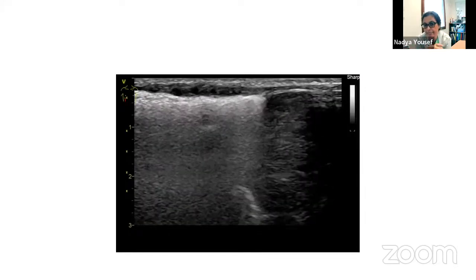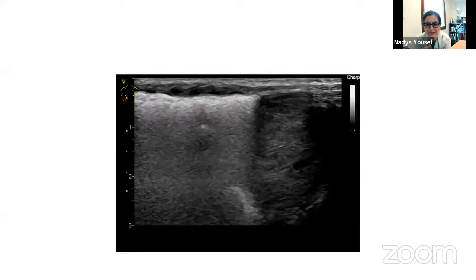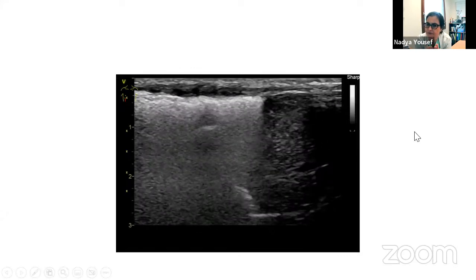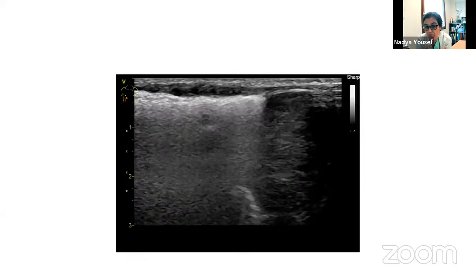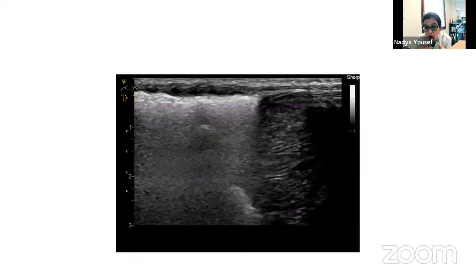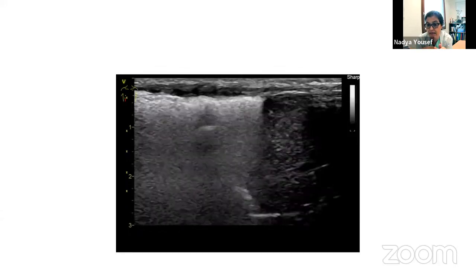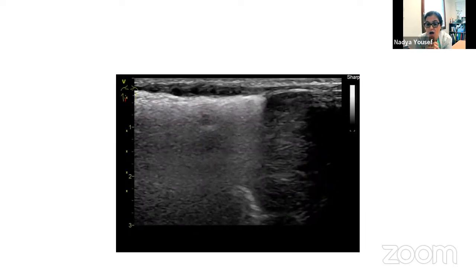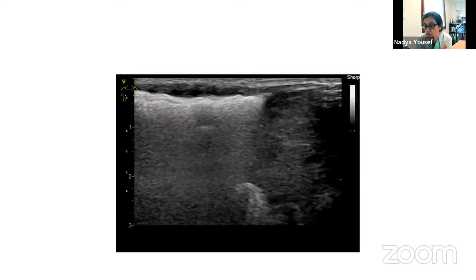That's possible. But in this clip, the pleural line is irregular, but there is no shred sign. There is no discontinuity. It's continuous. If you had a break in your pleural line, then that would have been a probable diagnosis. But here we don't have it. So we don't really know whether it's an A-line or not. I'm sure when you scanned the patient, you were able to assess for that. Maybe there is a part that we're not seeing in this clip where there is a sign of consolidation at the pleural level. But if this is the only place you see this and nowhere else you have any changes in the pleural line, it's not a consolidation by definition.